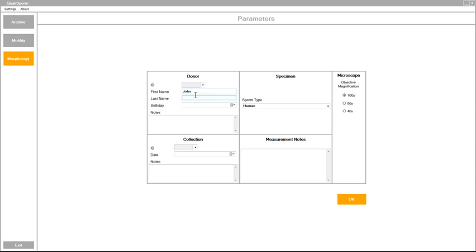All data is automatically stored in archive so that later you could retrieve previous measurements.